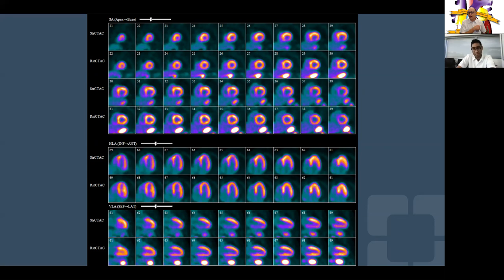With dobutamine PET, you normally see a dramatic decrease in left ventricular size in normal patients, as the patient is imaged at peak stress on the camera — almost cavity obliteration similar to dobutamine echo. In this instance, the cavity size did not change from rest to stress because we did not reach maximum dobutamine dose, yet we still obtained a diagnostic test.